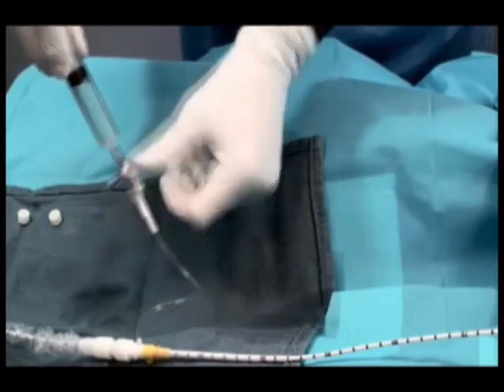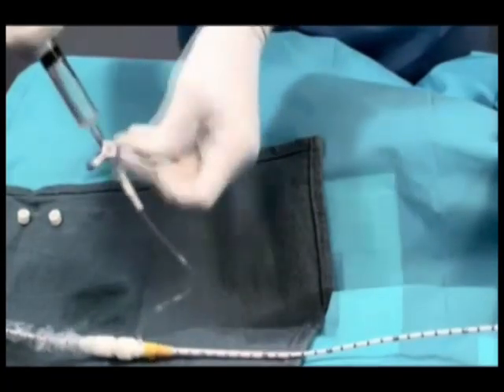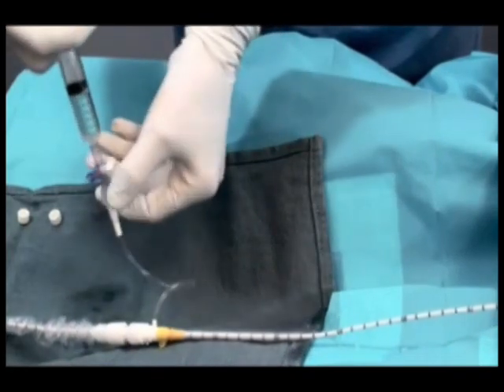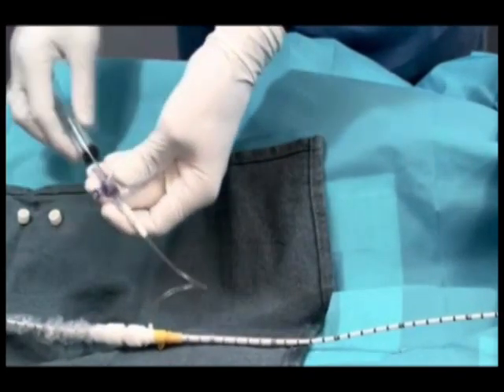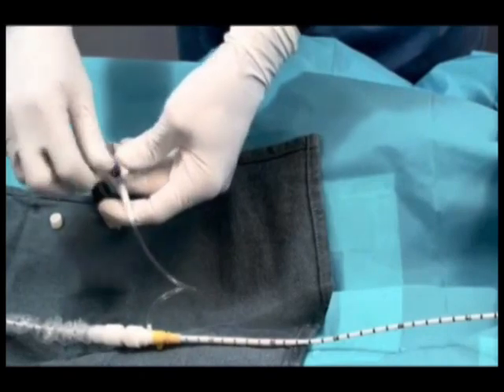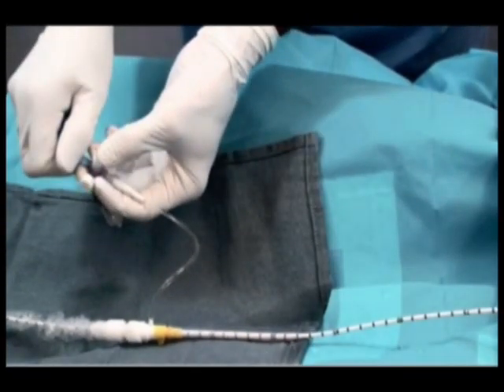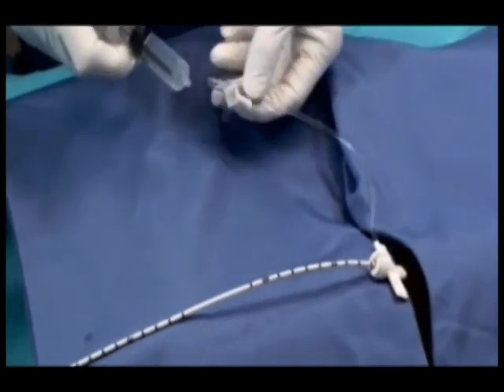Attach a stopcock and flush the repositioning introducer prior to advancing the introducer. Be sure that the stopcock is closed after flushing to prevent bleed back. Place 2 dead-end caps on the stopcock to prevent further usage. The side port should not be used to give medication or draw blood because the blood could potentially clot. Pressure bags should not be connected to the side port of the repositioning introducer.